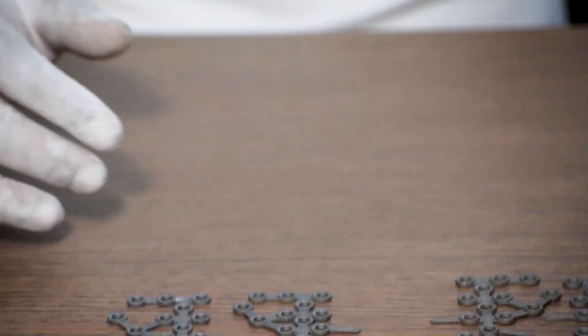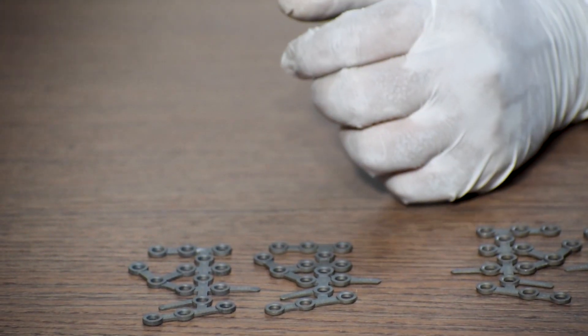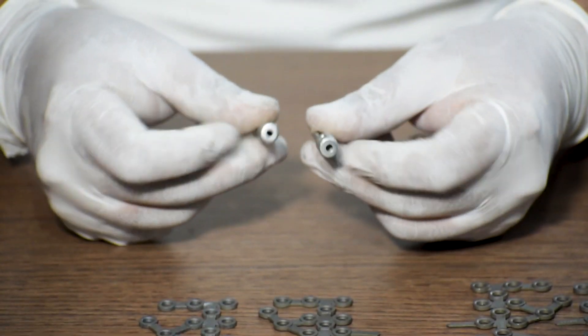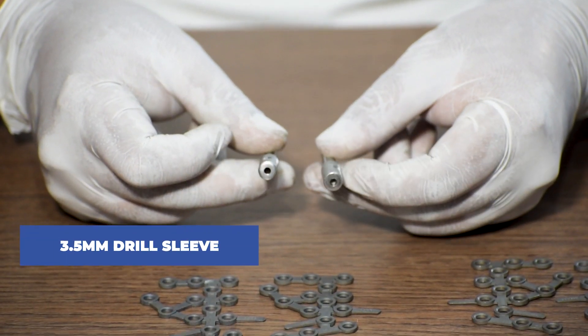Now the instruments required for the fixation of this calcaneal locking plate are as follows. First, we will need a 3.5 mm drill sleeve.